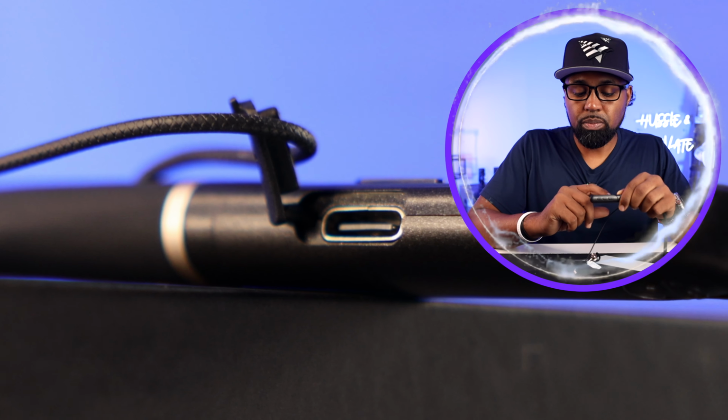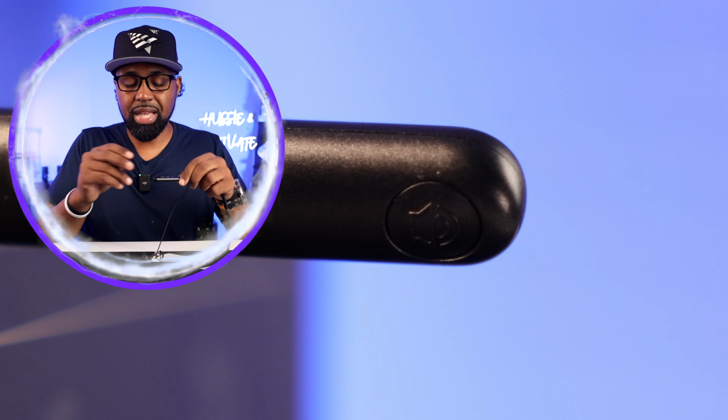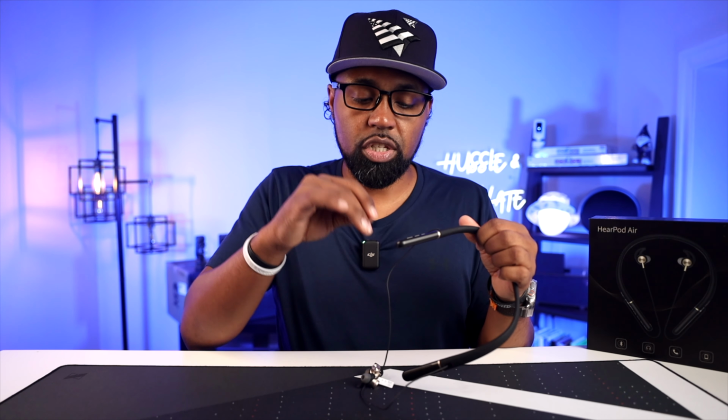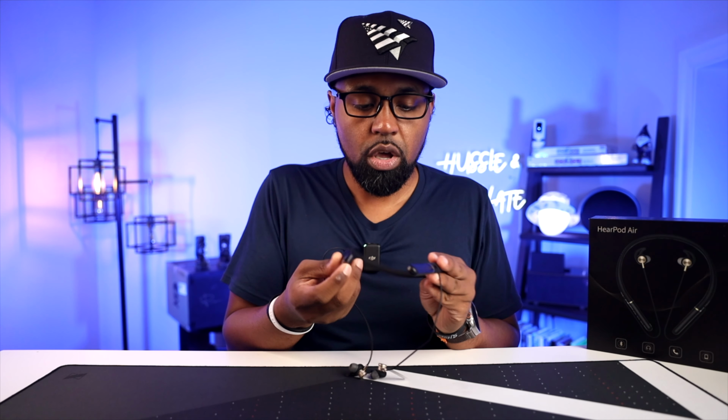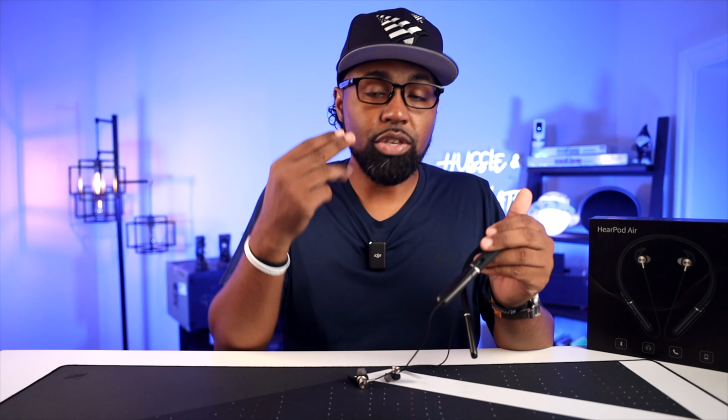So the left one will be down, the right one will be up. And then you also have the USB Type C port on the back side of that. You have your multi-function button on the inside, and I'll get into the other button functions when I get inside the app. And you also have your power button as well, and it looks like you have your microphone on the right side.